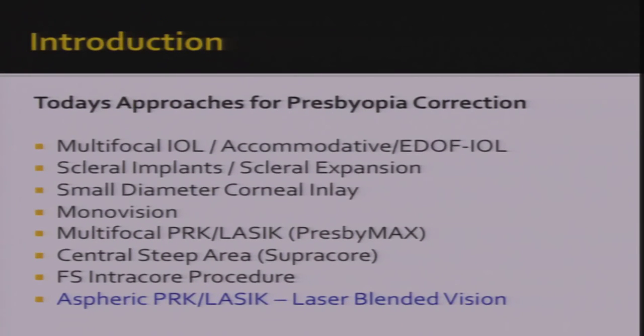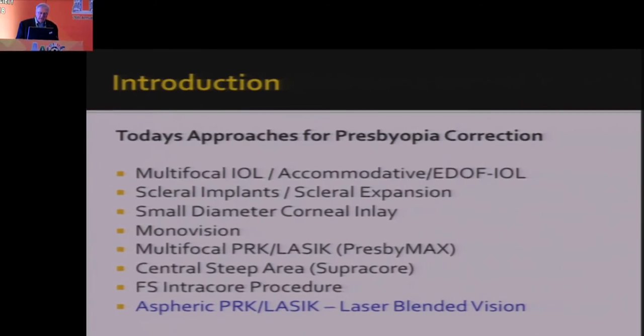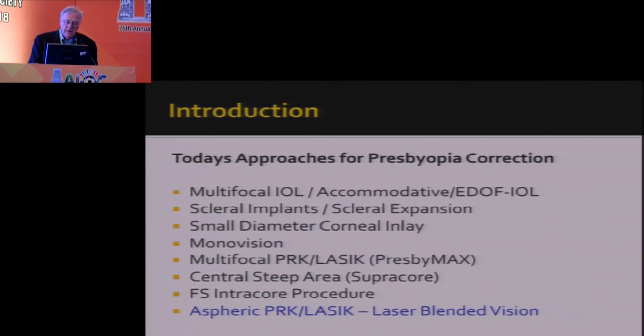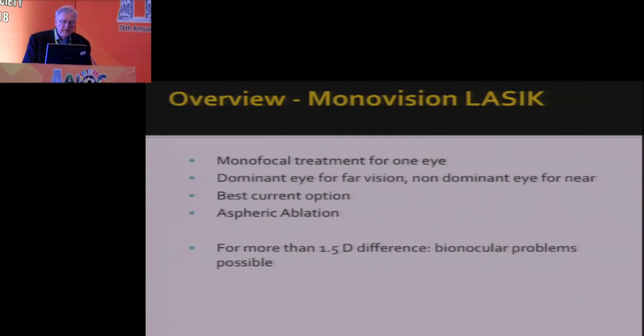Today, approaches for presbyopia correction are the multifocal IOL, the EDOF, the accommodative IOL, scleral implants, small diameter corneal inlays like Kamra or Presbylens, monovision, multifocal PRK LASIK as Presbymax, central steep area with Supracor, the femtosecond Intracor procedure, and the aspheric PRK LASIK like laser blended vision.